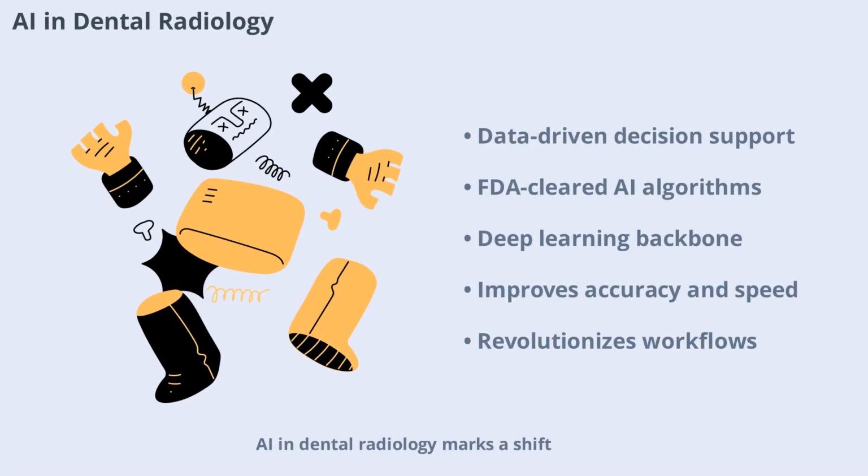AI in dental radiology marks a shift from subjective interpretation to data-driven decision support. By analyzing large datasets, AI systems identify subtle patterns and landmarks that may be missed during routine exams. The FDA has cleared over 115 radiology AI algorithms, with dental imaging software increasingly recognized as medical devices.